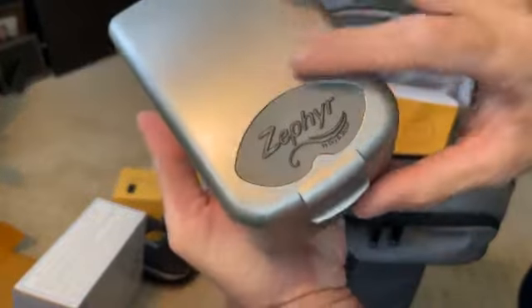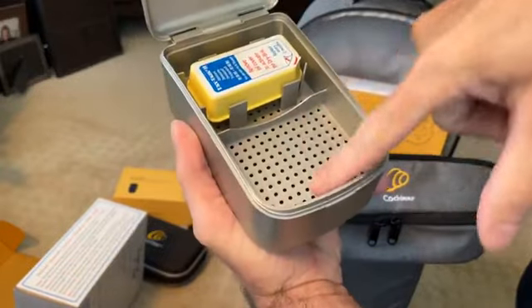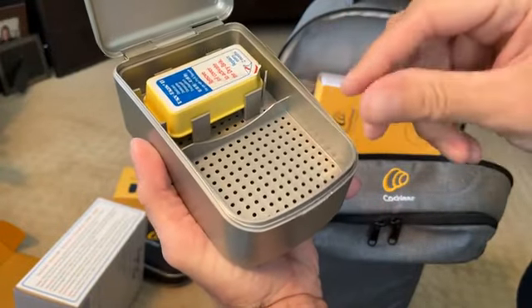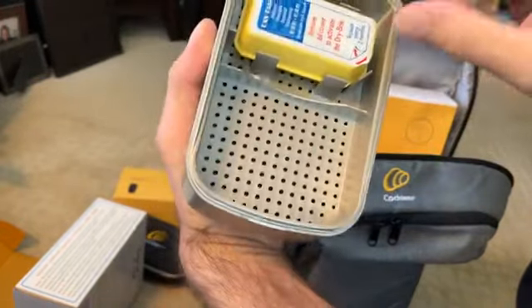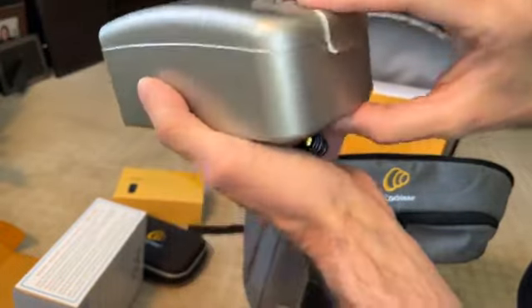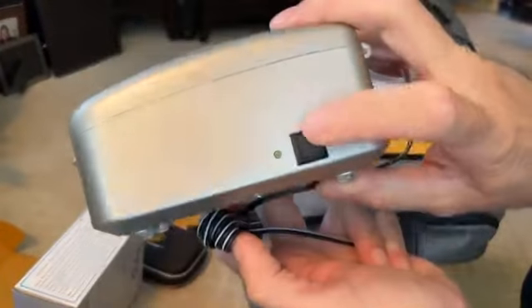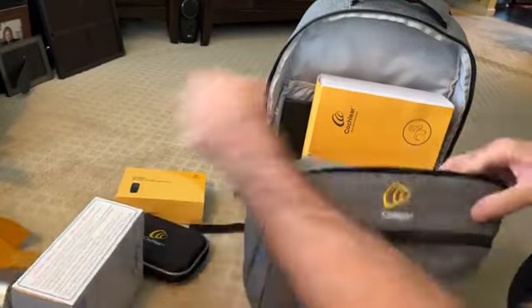It naturally comes with the dryer, so you can keep it by the bed or the bathroom, wherever. At the end of the night, take your device off, take your implant off, lay it in here with the compartments open so everything can breathe. Push the button and let it sit there and it'll dry, and you're ready to go for the next day.